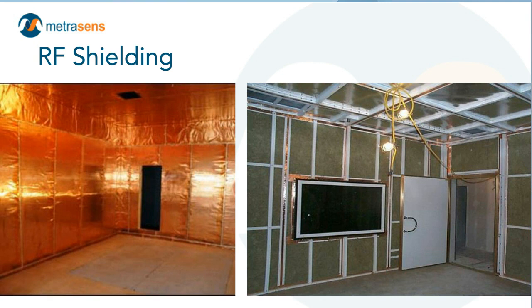On the right, you're seeing a panelized system, and the green pieces in the middle of the panel are actually sound attenuation that help reduce sound transmission from the MRI scanner room to other spaces. Again, just a visual aid.